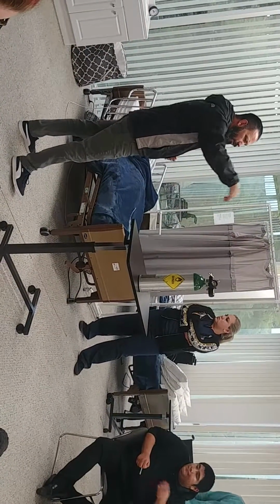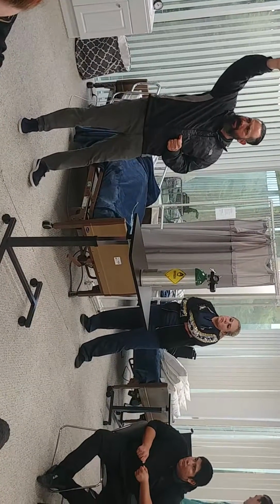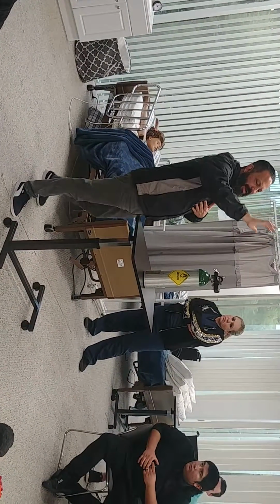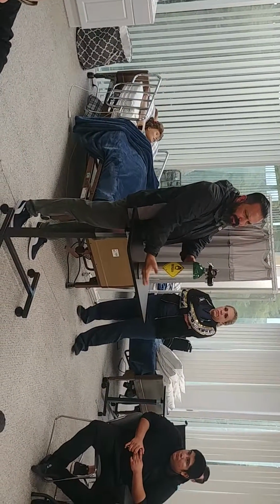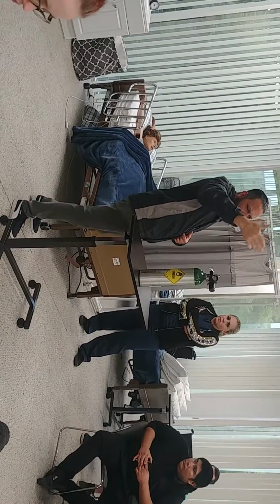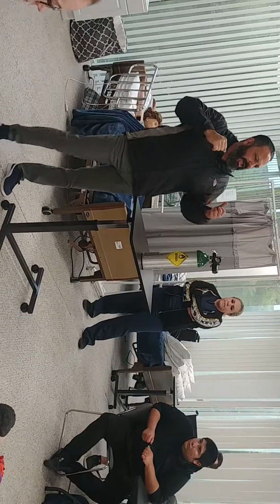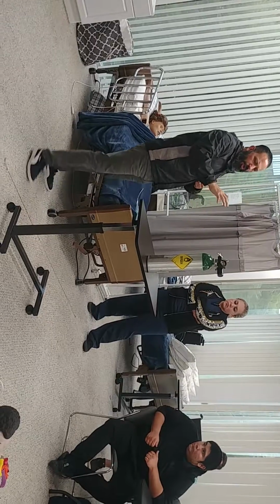We get into larger cylinders, like G cylinders and so on, that are mounted inside the wall of the ambulance. Once we get the patient into the ambulance, we can transfer them, because this is only going to last for so long. We hook them up to the unit supplying the ambulance, which has a larger capacity, so we don't have to worry about them running out. And then you have permanent stations in hospitals and so forth. So just be mindful.